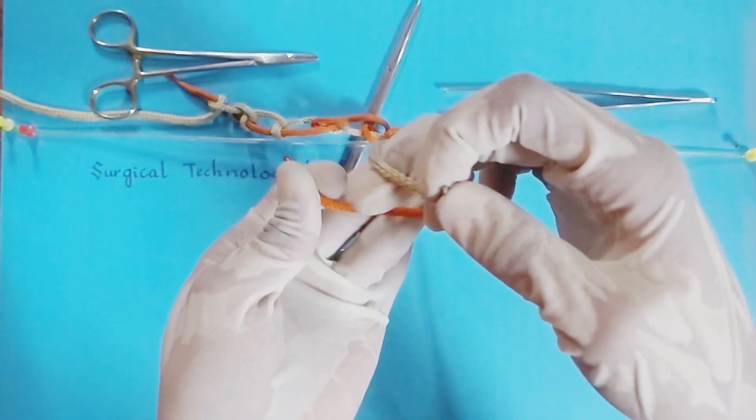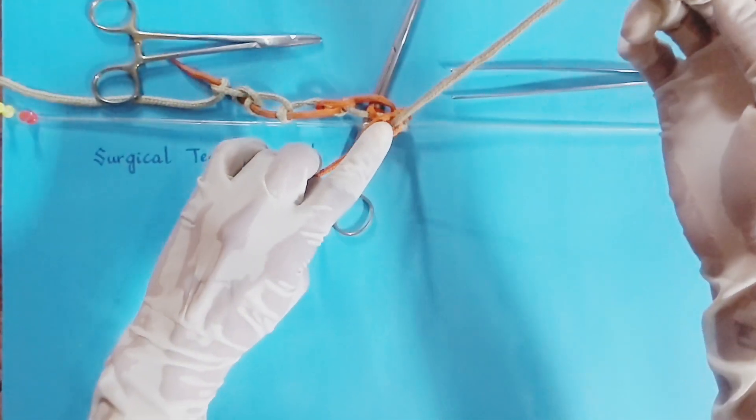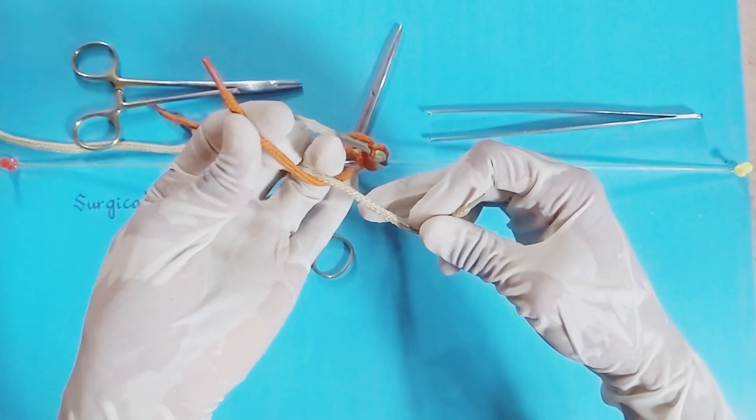Then place the other end of thread on middle and ring finger, then slide the thread from middle finger and hold between middle and ring finger.